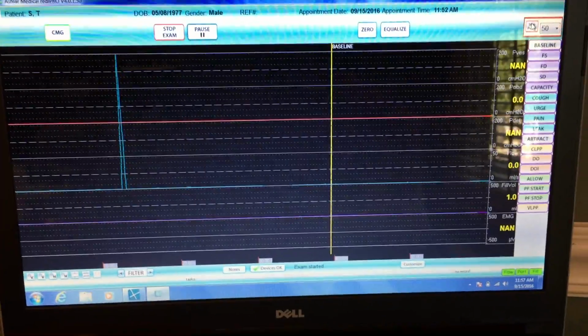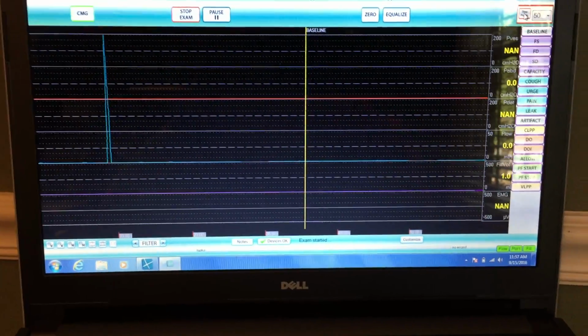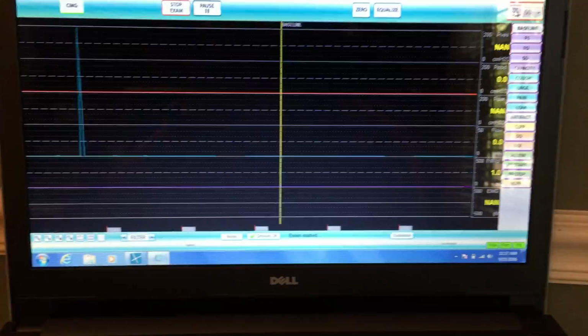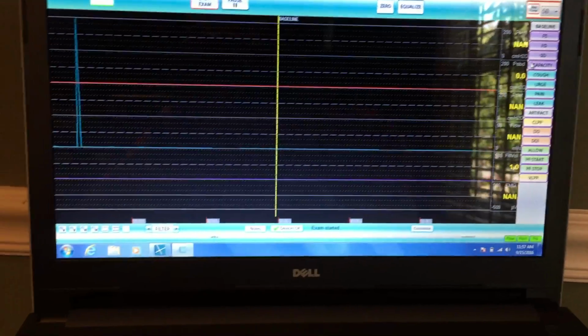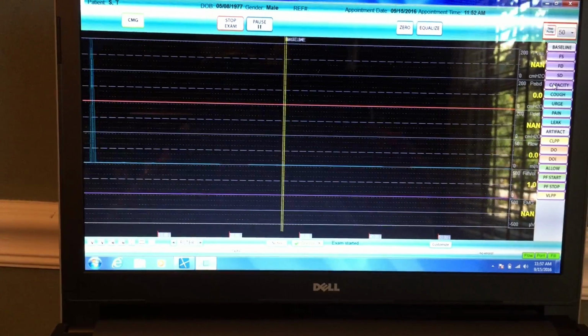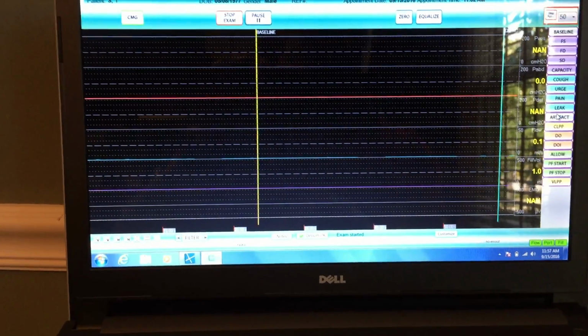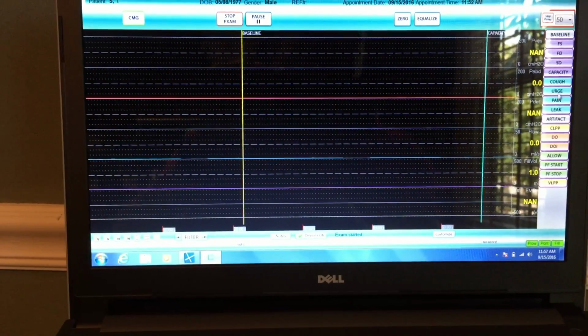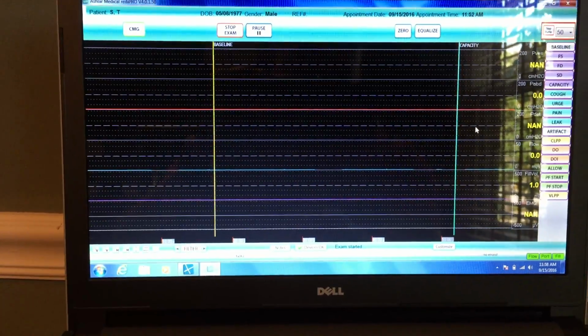Momentarily the pump will stop and tell me that there's no fluid going through. It's doing its best, but it's not sensing any change in pressure. So there the pump stopped. We can continue on with a normal study at this time. When we get to capacity, we can mark, and again, these event markers we can configure to whatever the needs are, and really the same thing with the graphs themselves.